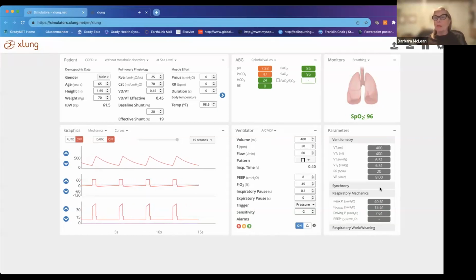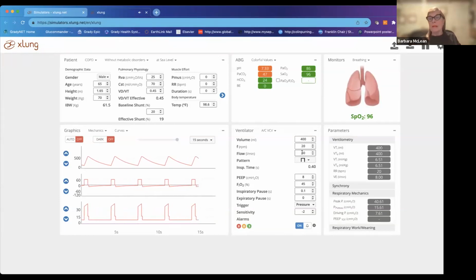I want to remind you, when peak inspiratory pressure is high, your airways are more resistant or they're less compliant. Alveoli are really compliant. The airways are about resistance. You have to rule out all the resistance issues. Remember, mucus plug, coughing, tube is in the wrong place, you're tonguing, you're biting, you're agitated, you're breathing against the ventilator. Once you rule those things out, you now have to say, should I change the volume or should I change the flow? Now, you're not the one who's making that decision. Your therapist is going to make that decision.